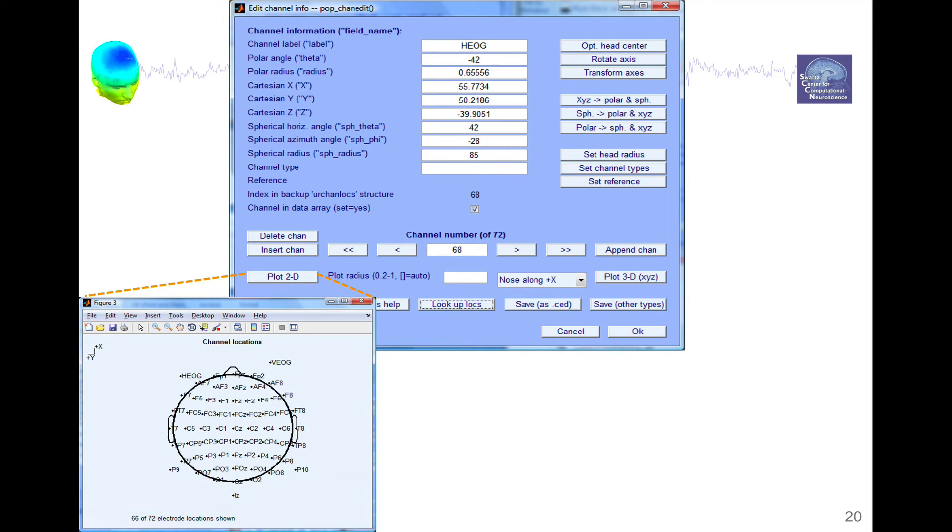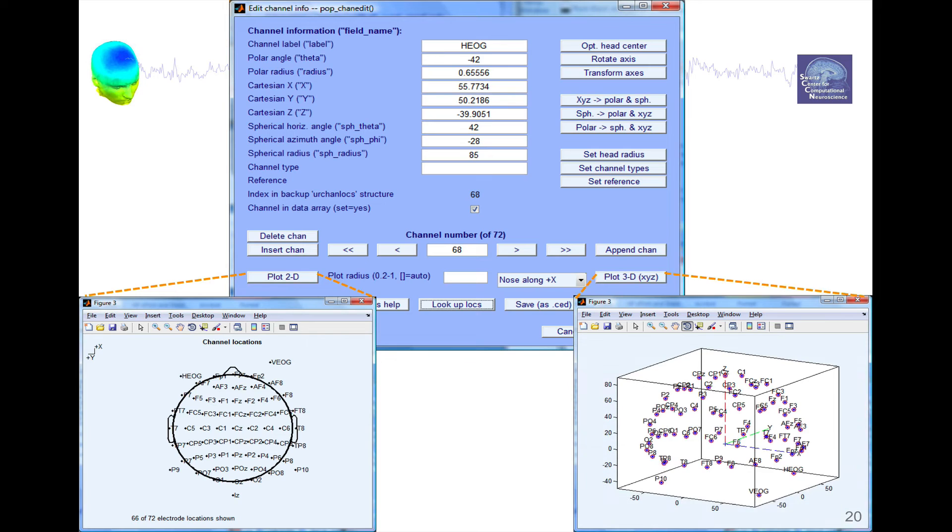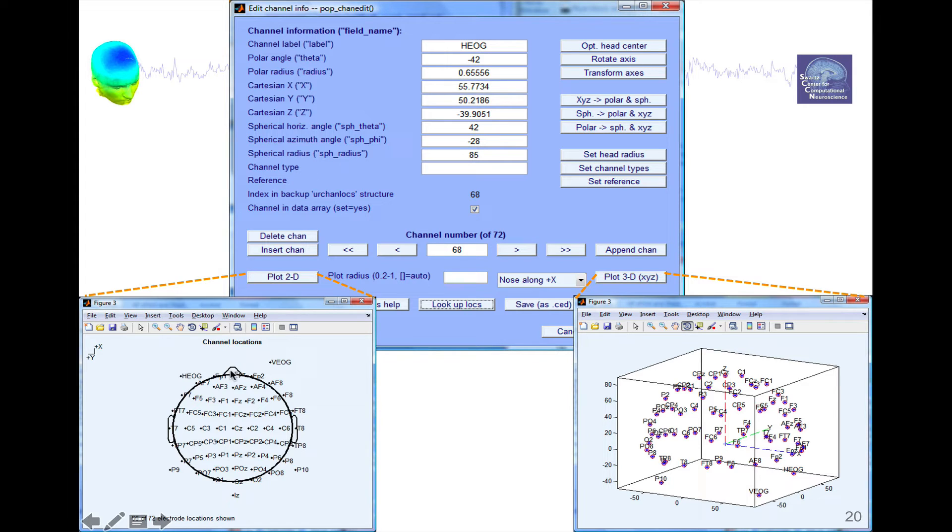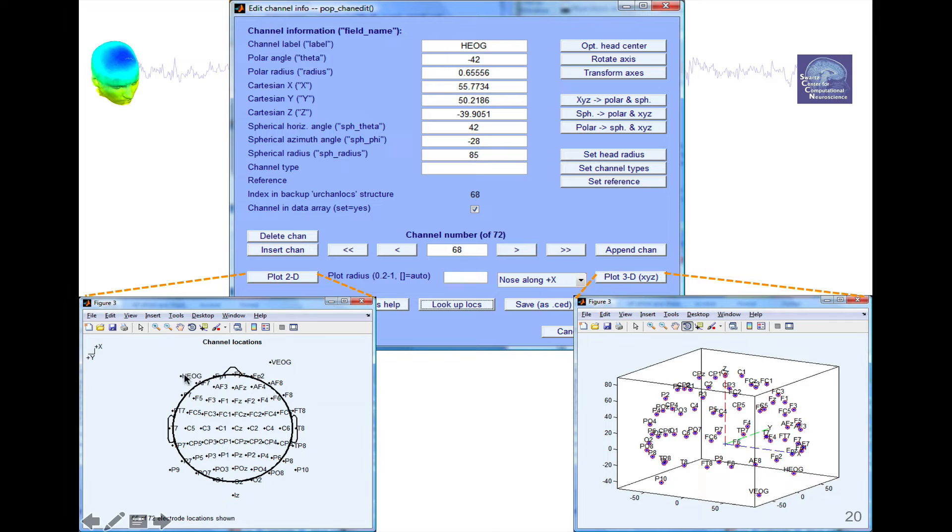Once you have channel location information, you can press one of these two buttons, Plot 2D or Plot 3D, to visualize your channels in 2D or 3D. Here in two dimensions, we see the head, the nose here is represented by this. And then the ears are represented on the side and the channels. Some of the channels are outside the head because they're eye channels.